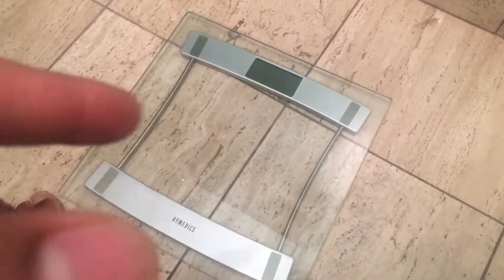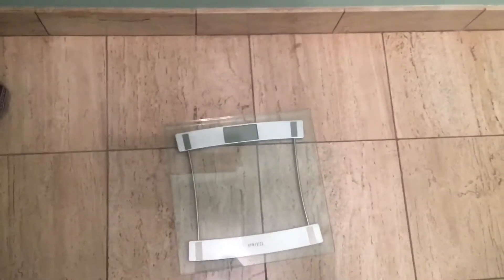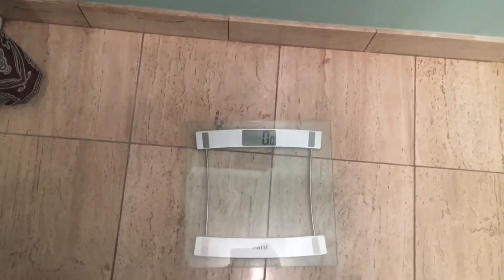Basically what it does is simple — you just step on it and it gives you your weight. This is how you activate it: you slightly step on it and it turns on, and right when it turns on, you're able to weigh yourself.